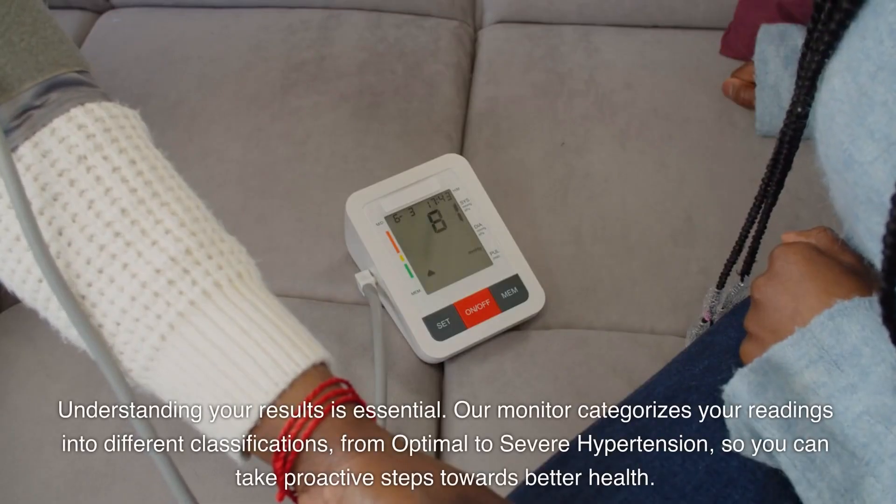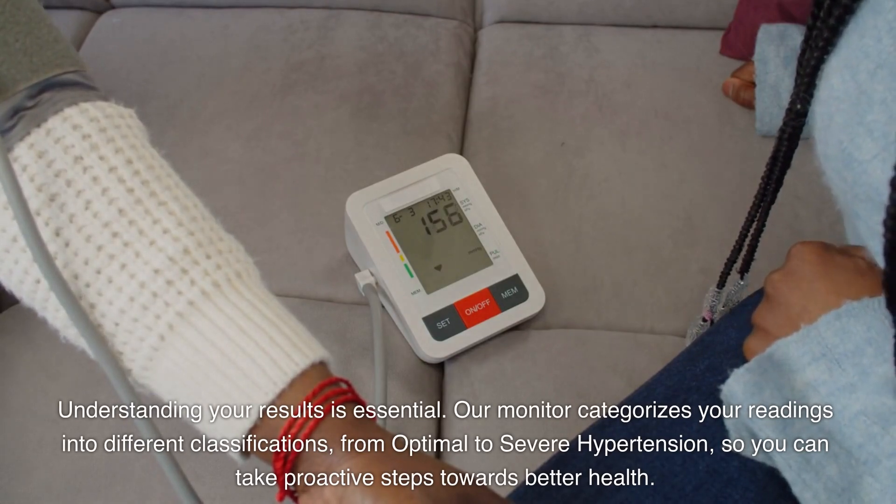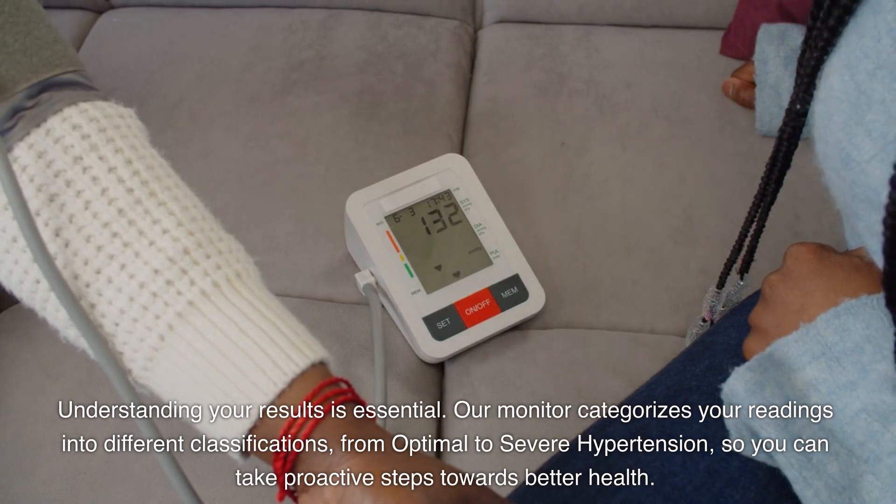Understanding your results is essential. Our monitor categorizes your readings into different classifications, from optimal to severe hypertension, so you can take proactive steps towards better health.